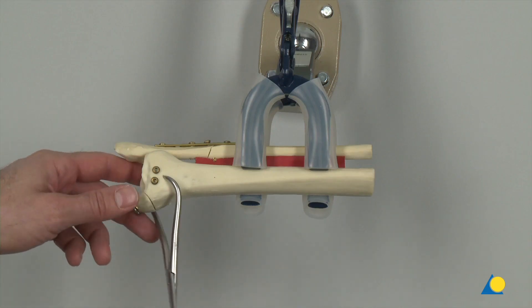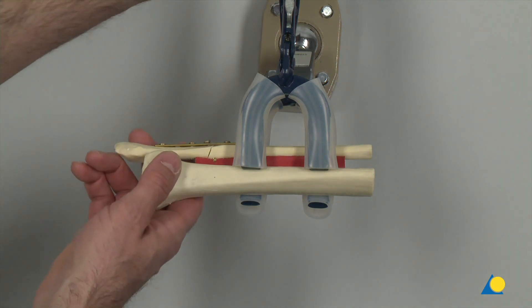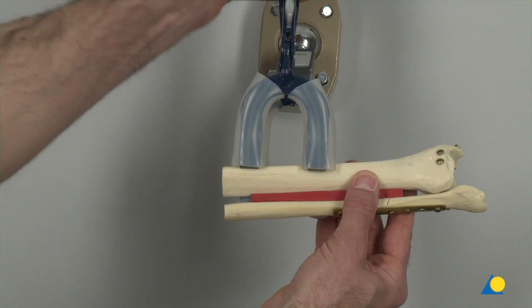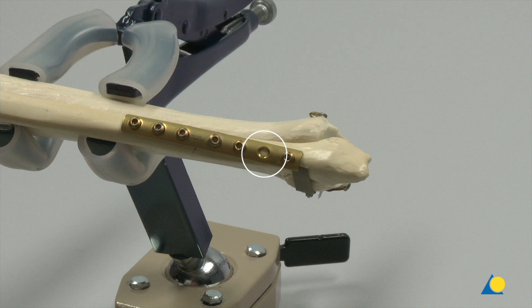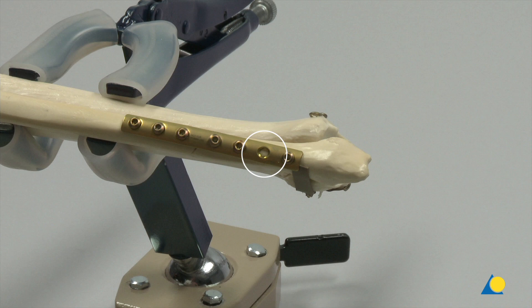The reduction forceps is removed to facilitate the insertion of the position screw. The bone model is released from the clamp and rotated 180 degrees, then returned to its original position. In the clinical situation, the ankle is dorsiflexed for the insertion of the positioning screw. This ensures that the upper ankle joint is at its widest position.